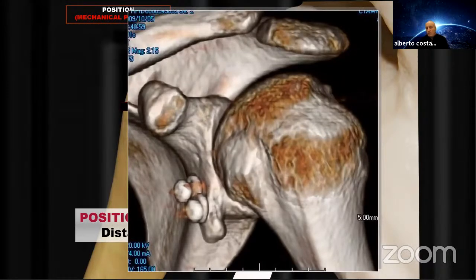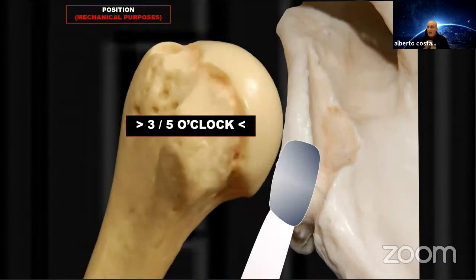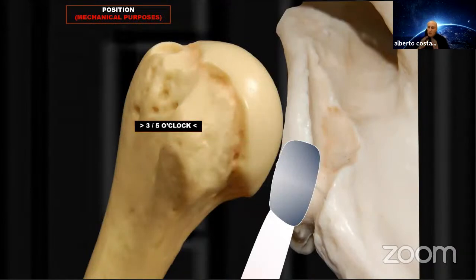Because if you go too distal, your graft will be lower, like in this case, and your inferior screw will keep a small amount of bone. So it's not useful to stabilize the graft. So the ideal position is between 3 and 5 o'clock.